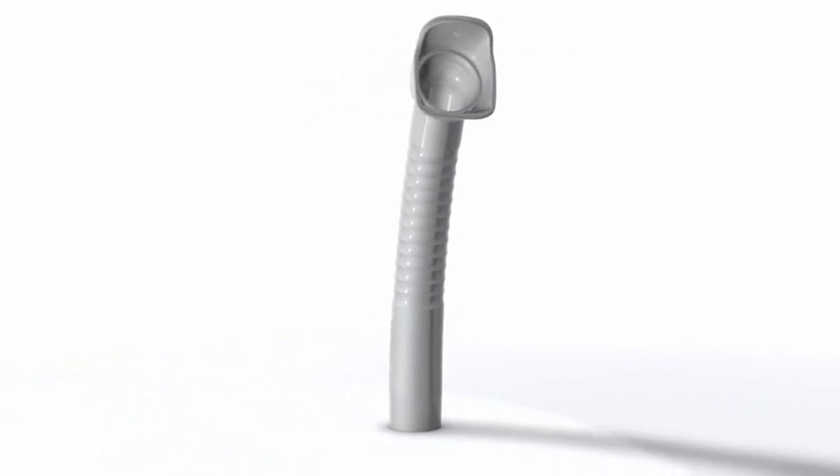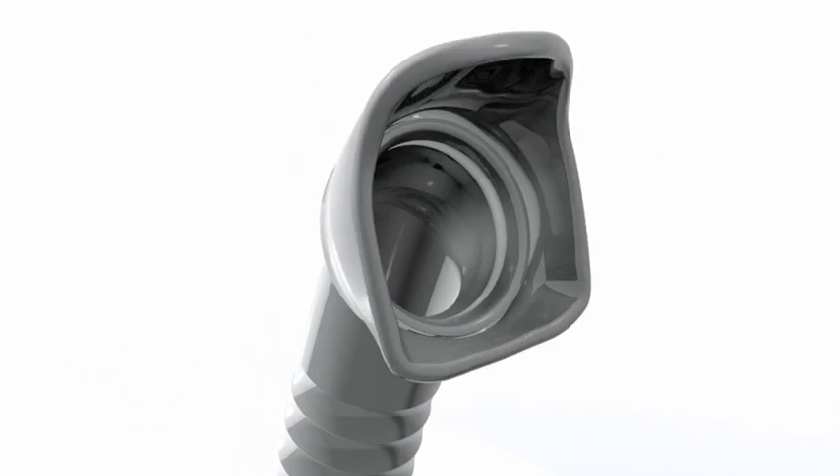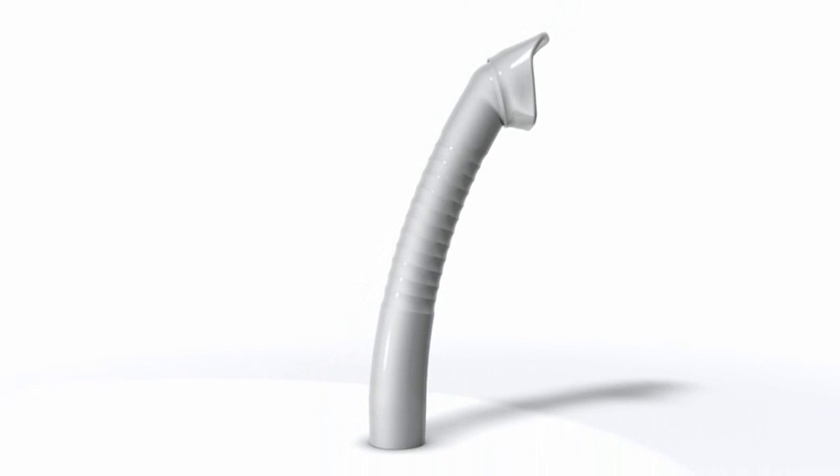The Prophylaxis cannula with ergonomic design and non-slip surface is multifunctional and can be used for conservative, prosthetic and prophylactic treatments.